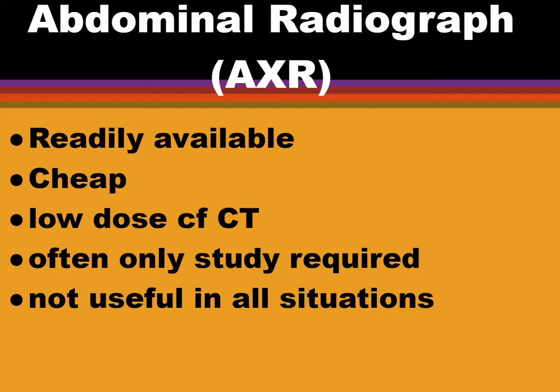Well, it's readily available. You can do an X-ray really quickly, not like a CT or an MRI scan. It's cheap compared to CT or an MRI. You know, it costs a few pounds as opposed to hundreds of pounds. It does involve radiation, but it's a much lower dose than the radiation that a CT is associated with.